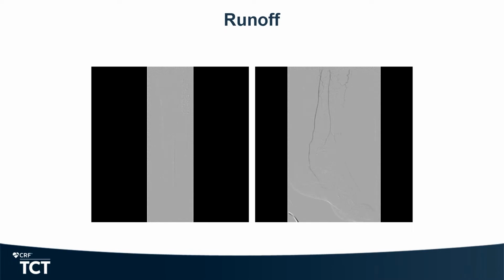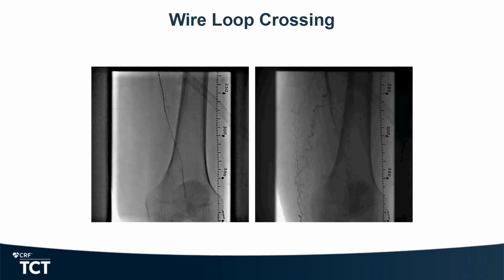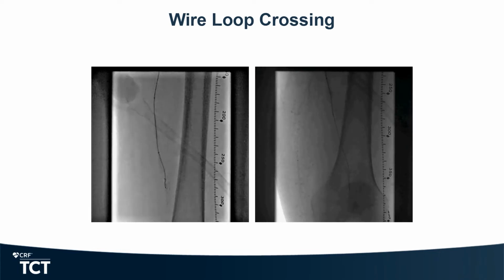This is the day in the life of the average interventionalist. And he's got disease that, you can see on the unsubtracted images, looks not to be that tough, but we had to go subintimal to cross. We used a loop wire strategy with an angled Nav across and a Glidewire, and we were able to get across relatively quickly. And that's when the fun began.